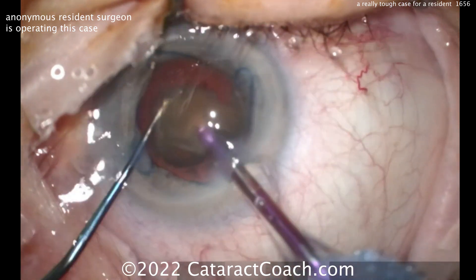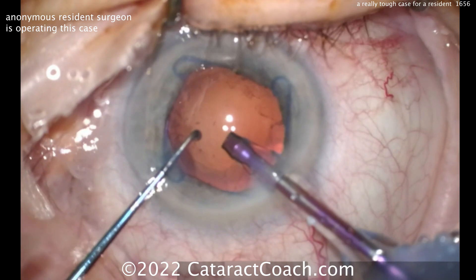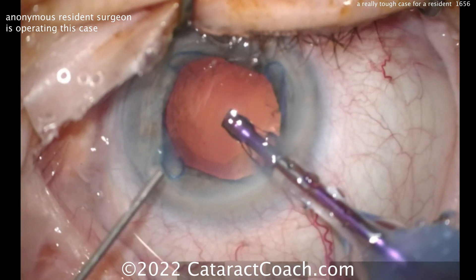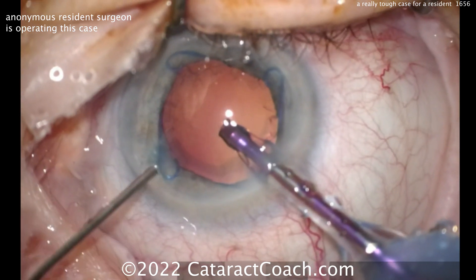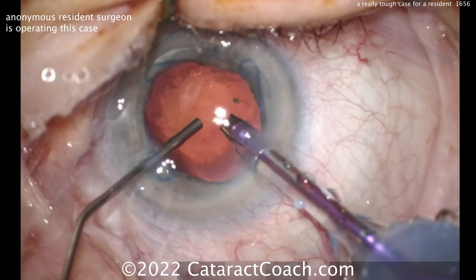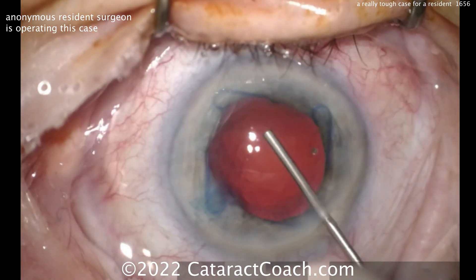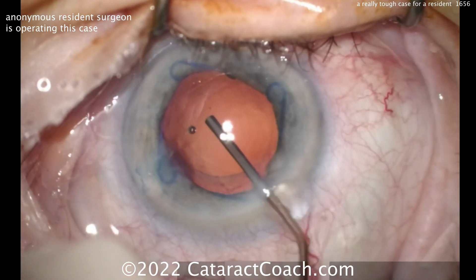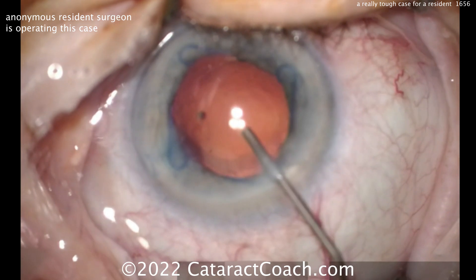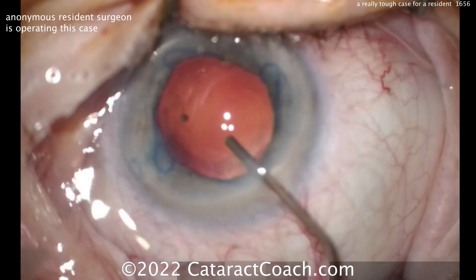Good job — you definitely have good hands. This is a very tough case, and this resident has only done 200 surgeries so far. For 200 cases in, you did a fantastic job — keep up the good work. Constructive criticism: first, you've got to do a much better job at draping — this is just not acceptable. Second, you certainly have to keep the eye in primary. That's a smart move right here — injecting the viscoelastic before coming out with the probe. I would have made a slightly bigger rhexis. Divide and conquer worked reasonably well, but you could have just done a stop and chop with a double-wide groove — that would have worked beautifully.